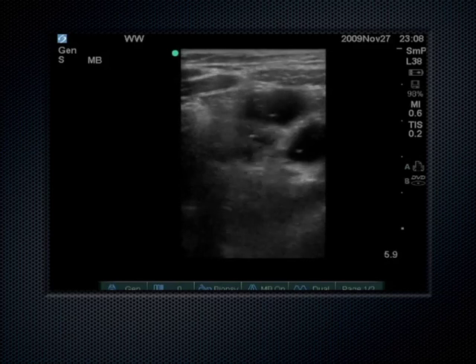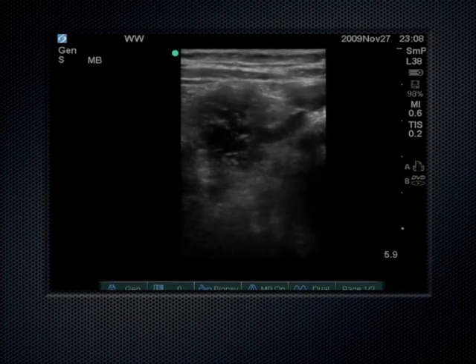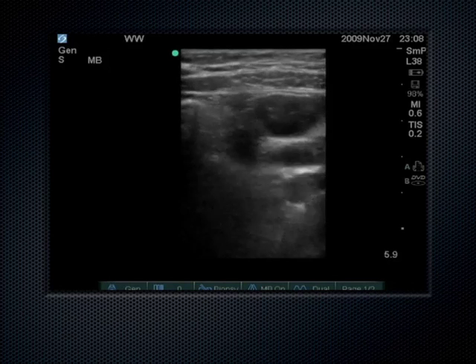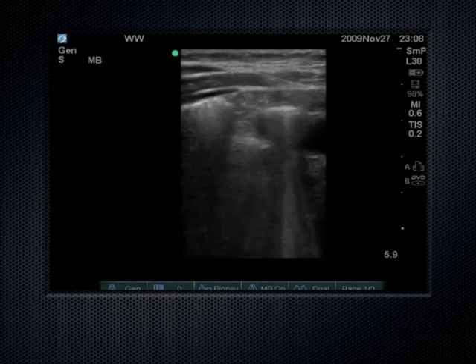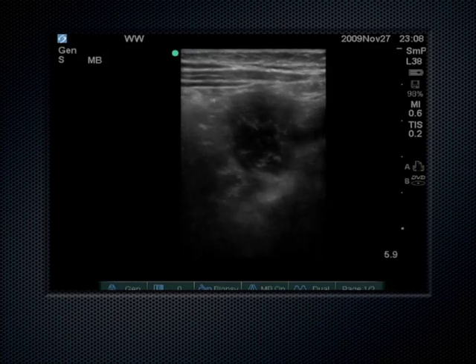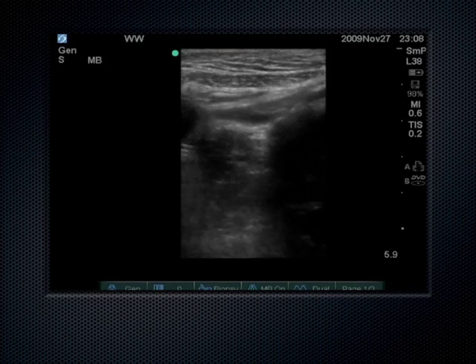Now, if you have appendicitis, all these areas down here in the peritoneal cavity get inflamed. So it's very painful to be compressing these things. This is the peritoneal lining right here. Okay, I can see that peritoneal lining very easily on ultrasound. Everything down here is all intestines, and there's psoas muscle coming all the way up and coming in contact with abdominal wall musculature.